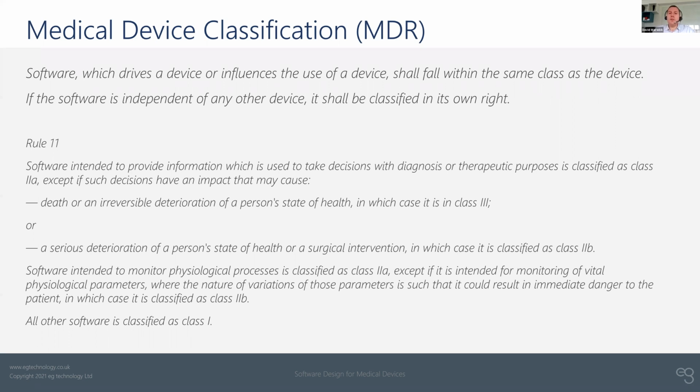And so, on the face of it, that and the rule that's on the screen at the moment, that sounds like it would probably fall into a 2A kind of classification. Because if it were to go further, if it were to say this person is still suffering from whatever, you should therefore do this, that's when you start to get into the highest categories of providing a diagnosis.